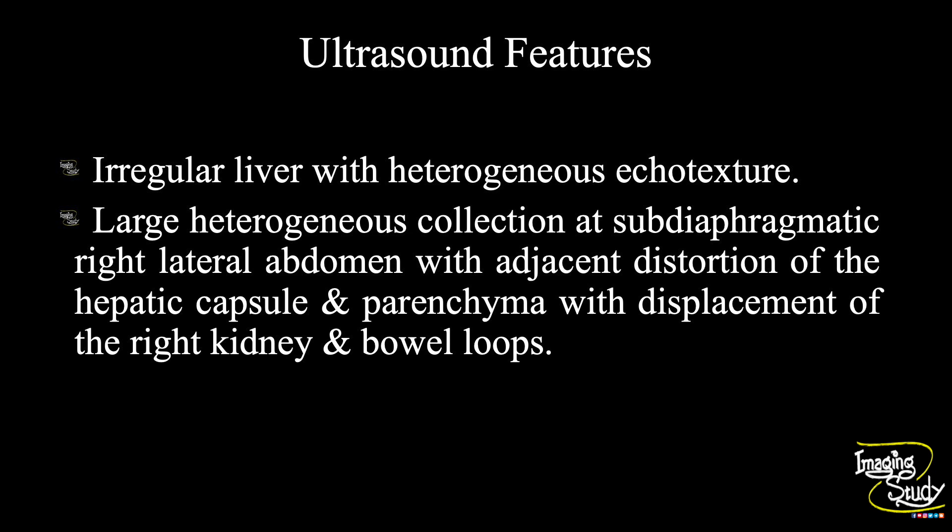So in summary, the liver is irregular with heterogeneous echotexture. A large heterogeneous collection is noted at sub-diaphragmatic right lateral abdomen with adjacent distortion of the hepatic capsule and parenchyma with displacement of the right kidney and bowel loops. These features suggest it as a case of hepatic hematoma.